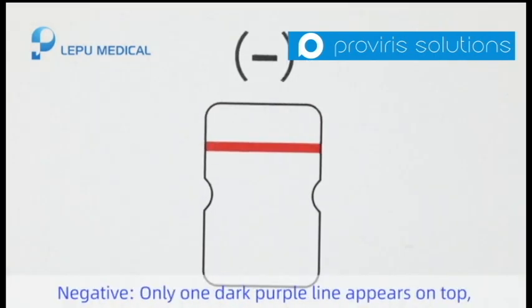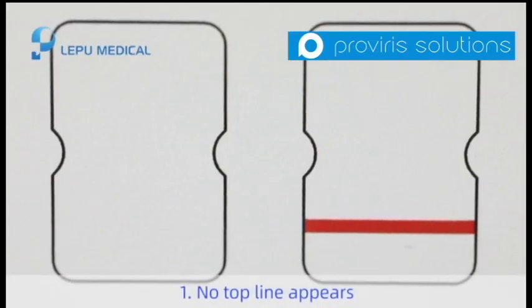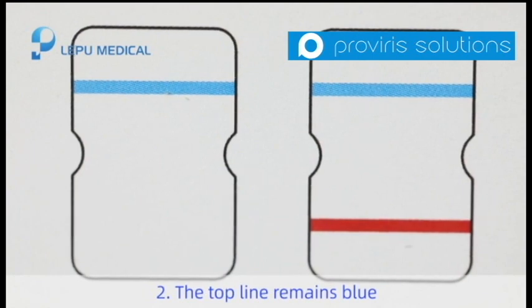Negative: only one dark purple line appears on top. The test result is negative. The test result is invalid if: 1. No top line appears, or 2. The top line remains blue.